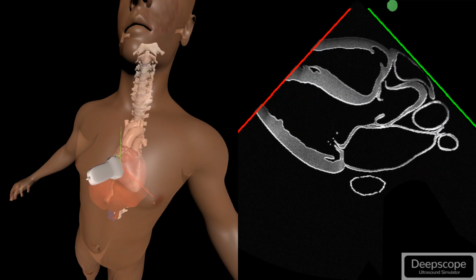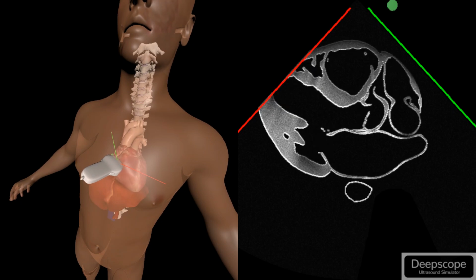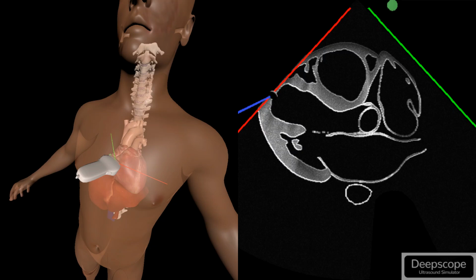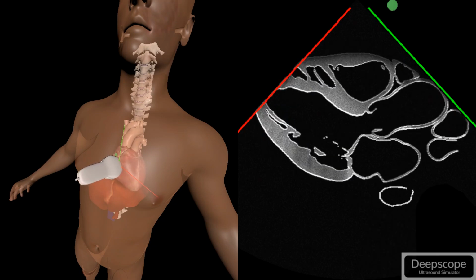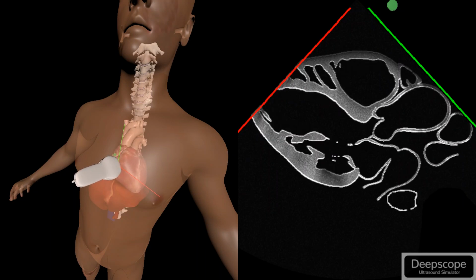So in summary, the LV cavity needs to be wide open. The rotational motion, rotation off axis, will cause an apical view to be capped. And then if we are parallel to the long axis, but the beam is not centered, we will then obtain the papillary muscles, which also gives you a falsely smaller LV cavity.